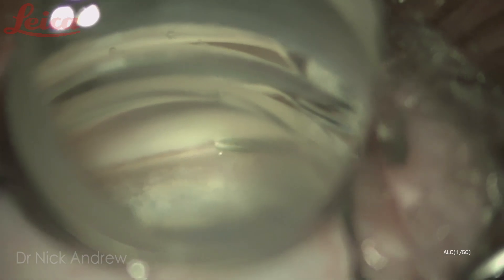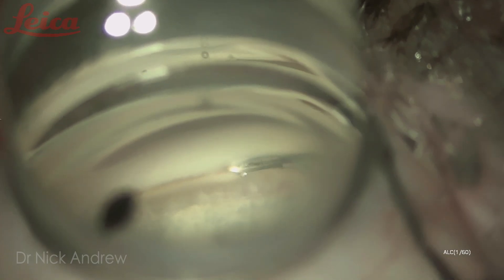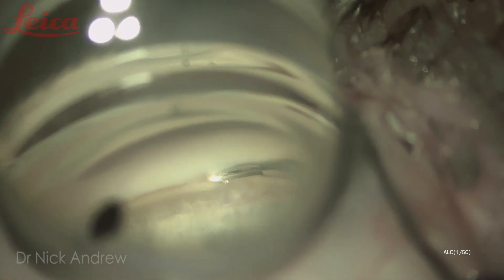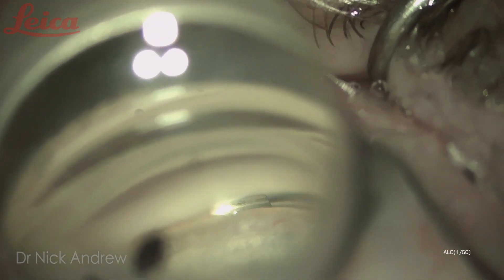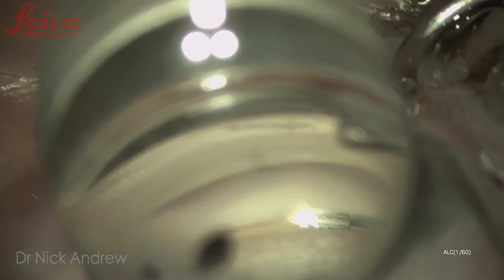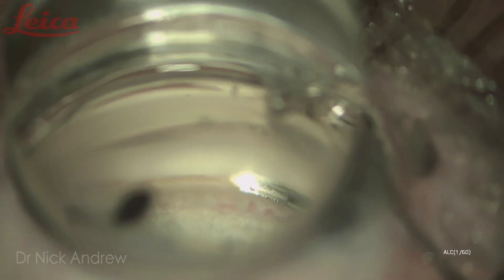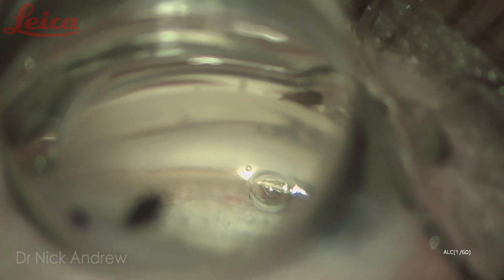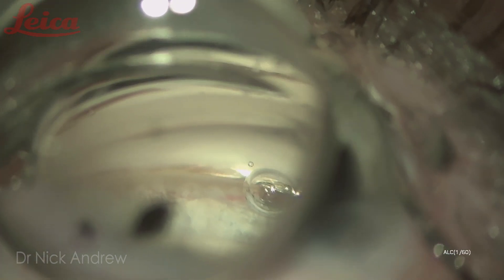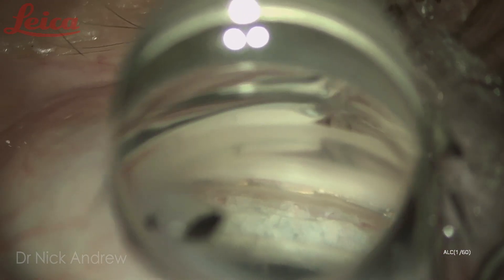Here's another case. I've pierced the trabecular meshwork and am working forwards. I'm having to work harder than usual in these videos because these eyes are over-inflated with viscoelastic to get better video quality, making it more challenging to embed the injector into Schlemm's canal. Really working and pushing forwards, then relaxing the hand — injector angled about 10 degrees superiorly. Completely relaxing the hand with no outward pressure against Schlemm's canal, and a very slow delivery of the hydrus. There can be adhesions within Schlemm's canal, so advance slowly, allowing adhesions to separate as the hydrus is delivered.